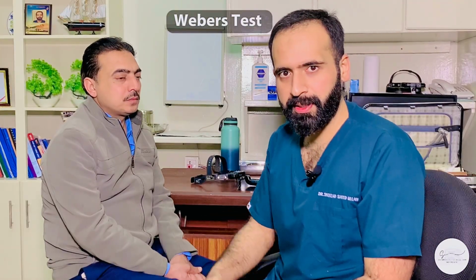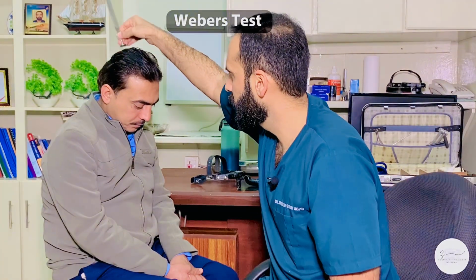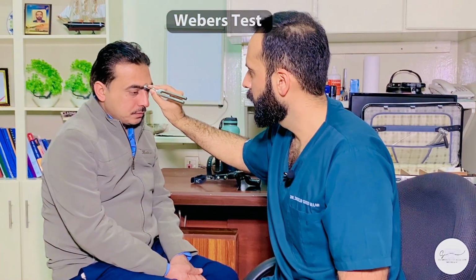So there are 4 places that you can place the tuning fork in Weber's test. It can be either on the forehead, it can either be on the vertex, it can either be on the nasion, and it can even be on the upper incisors.